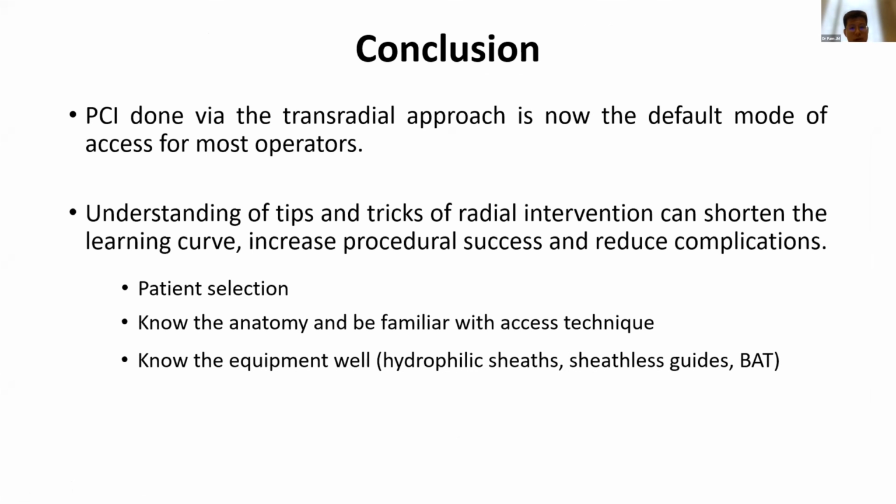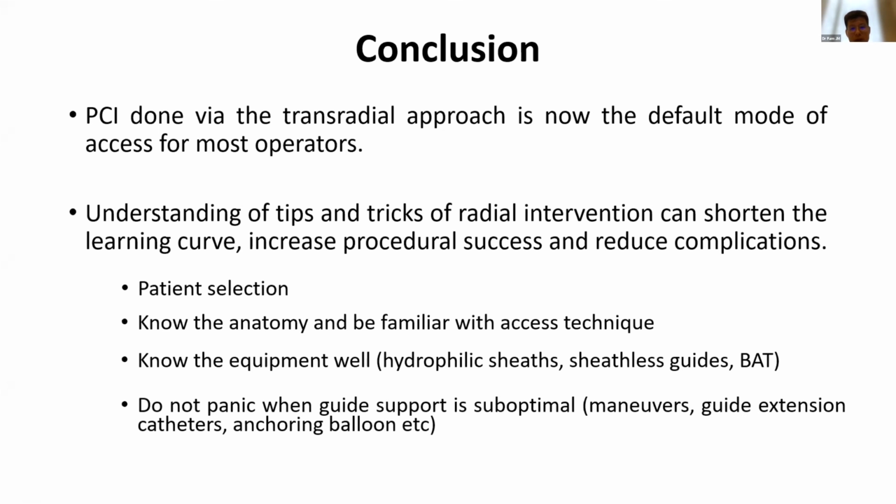Know your equipment well. Potentially you have hydrophilic sheaths, sheathless guides at your disposal. Do not panic when guide support is suboptimal. You can use various maneuvers, stiffer guides, or use of guide extension catheters or anchoring balloons. Last but not least, be familiar with possible complications and know how to manage them.